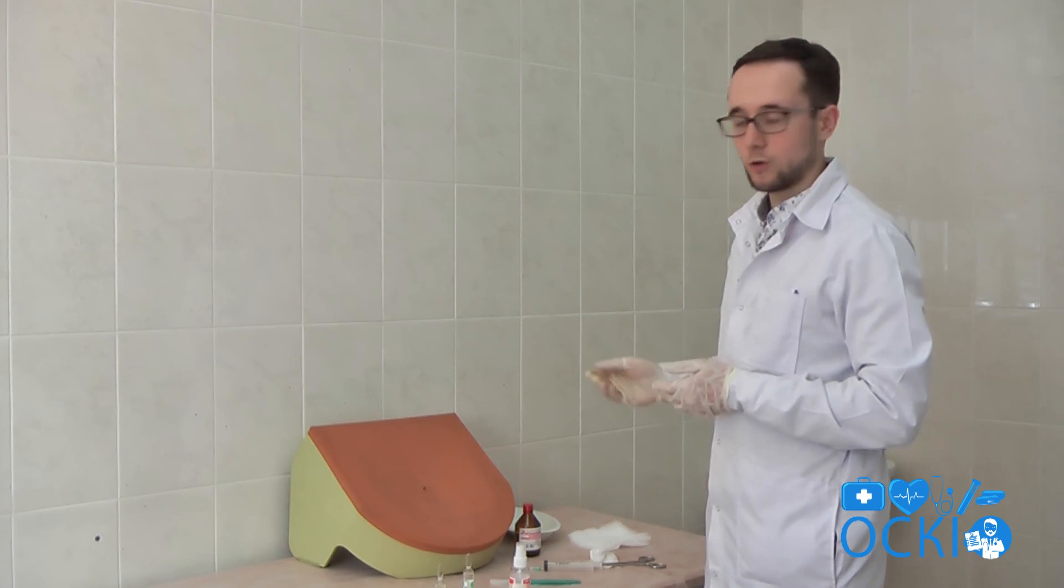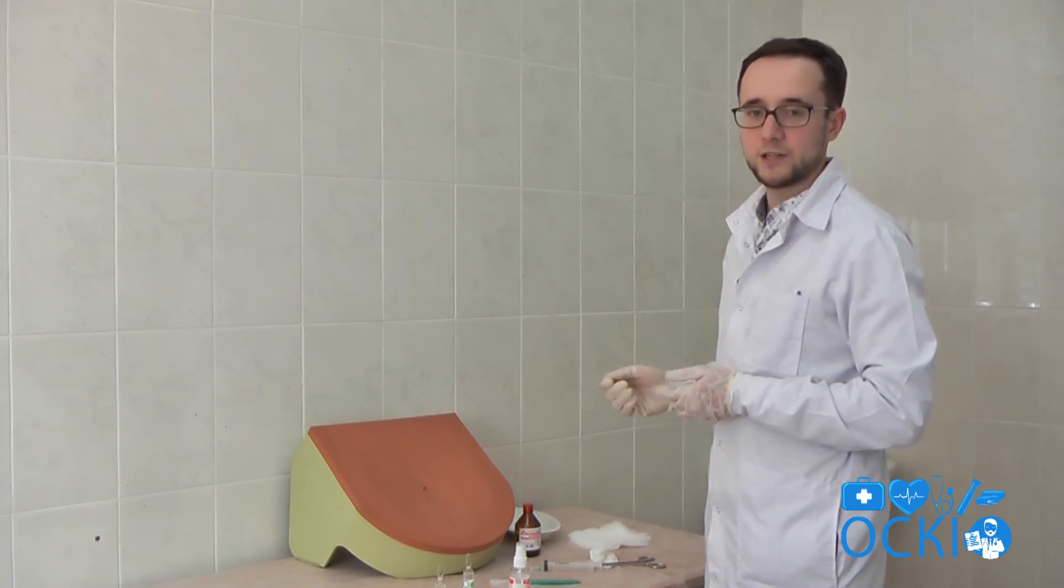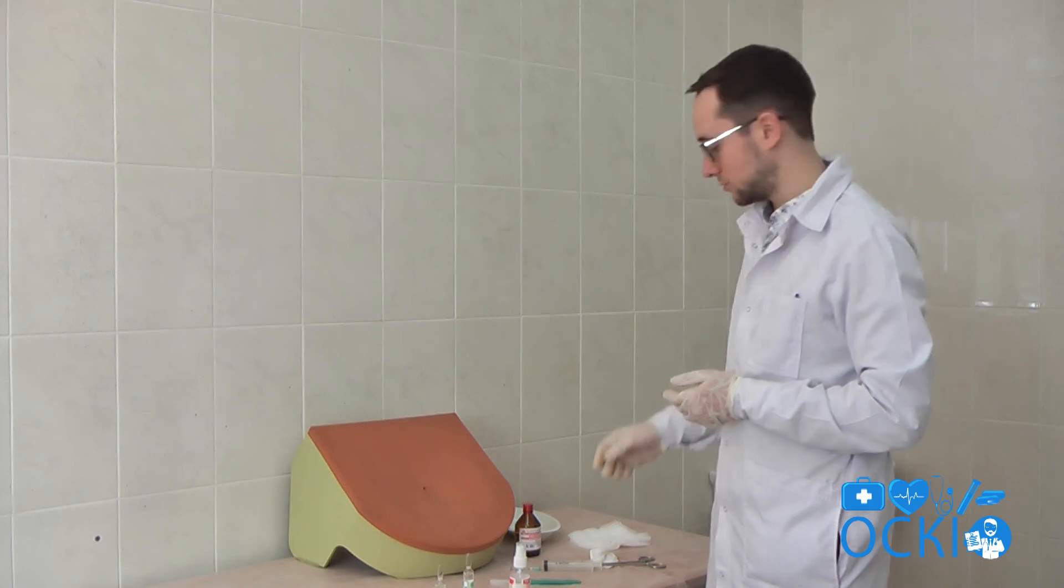Put stitches on the wound. Fix a drainage. Put antiseptic bandage on the wound.